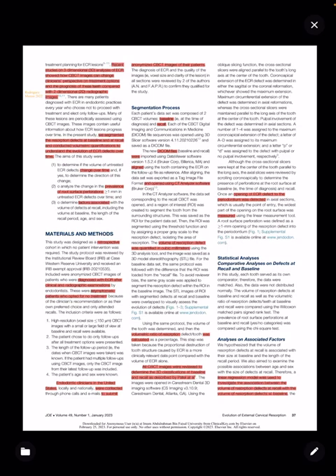For materials and methods, endodontic clinicians in the United States were contacted to submit baseline and recall CBCT records that meet the criteria of their patients diagnosed with external cervical resorption who opted to have no treatment.